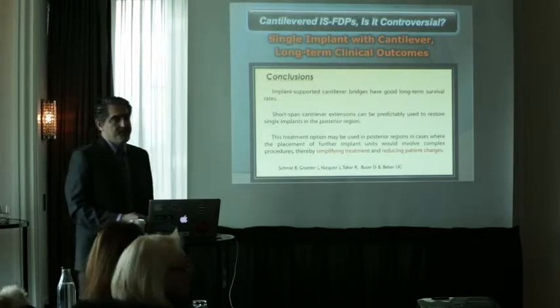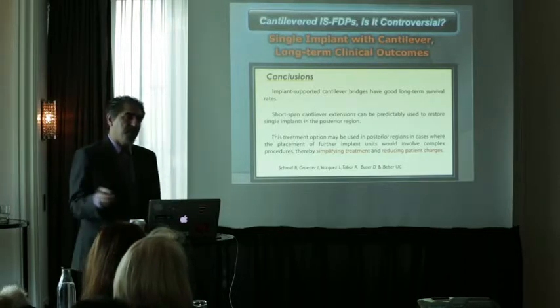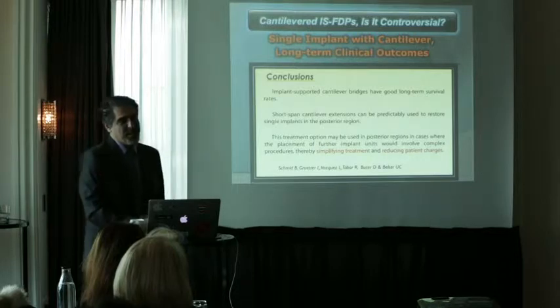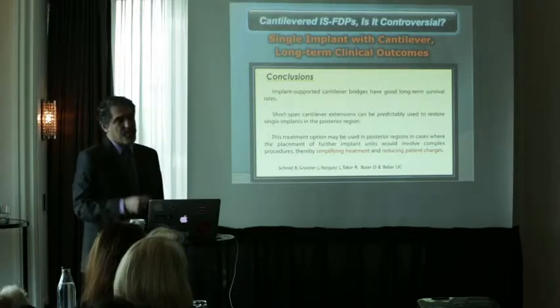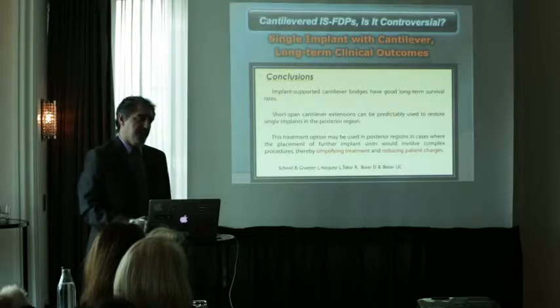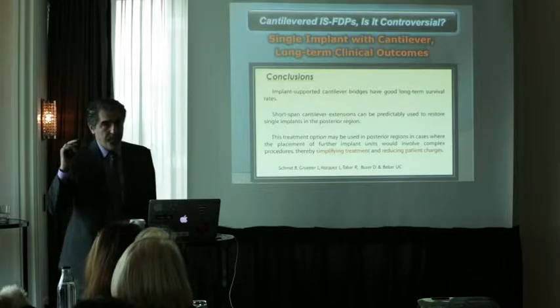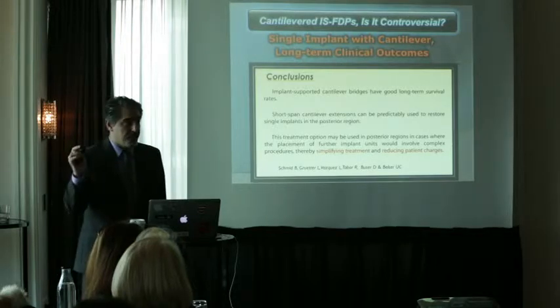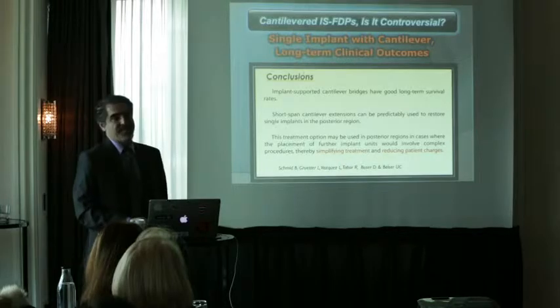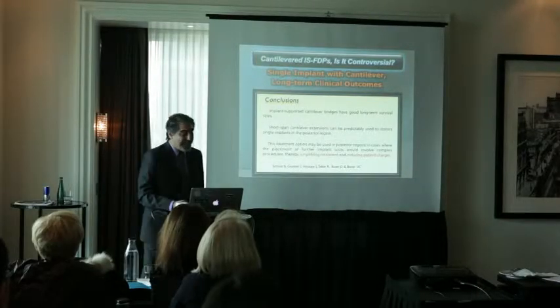Yes? Do they reduce the occlusion on the cantilever part? Yes, of course. Otherwise, you're going to have a lot of screw fractures. So you have to be careful. Very good point. You have to be careful with the load that you're putting on the cantilever. But it's not comparable to the cantilever where we put on our abutment teeth. So that's different. Yes. Was there any distinction between mesial and distal?